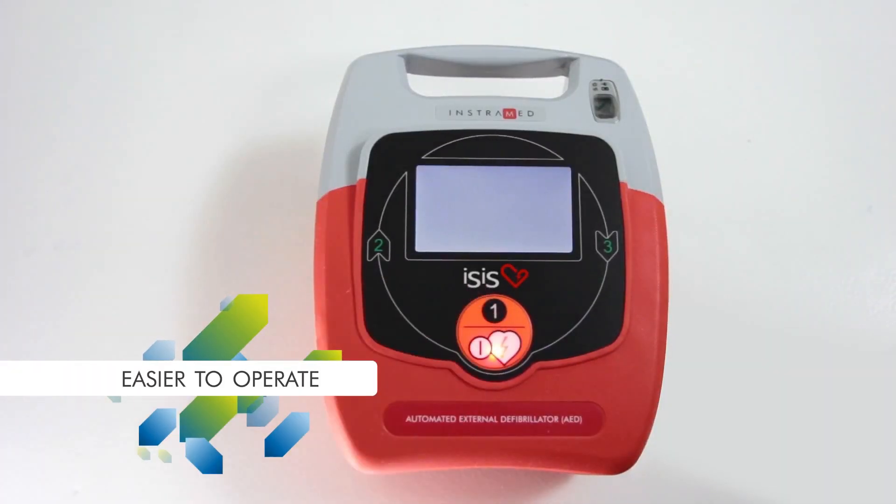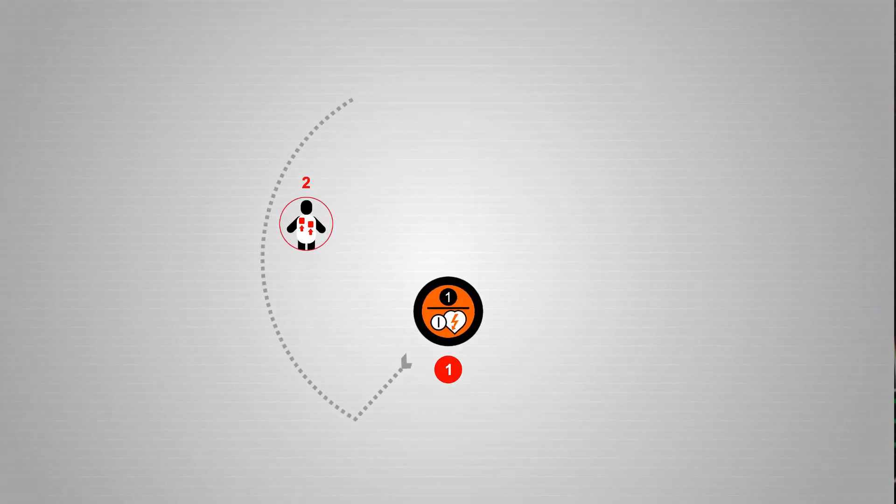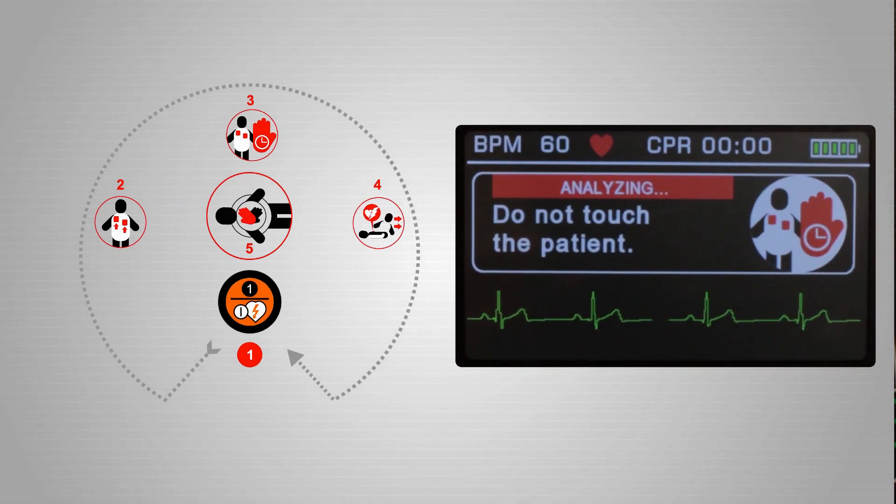Easier to operate: just press the only button on the front and follow the voice commands and the instructions on the LCD visual display.